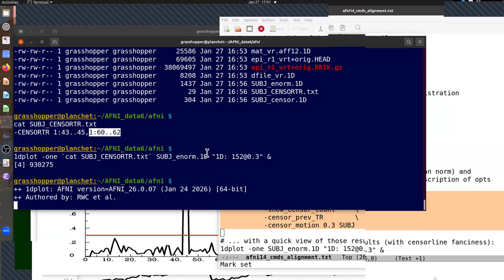Or you can use a reverse phase encoded data set and estimate the difference between warped in one direction and warped in the other direction. You take the kind of average and hope that averages out to be not warped. So both of those methods of correcting EPI volumes rely on doing a little extra acquisition at the scanner. If you don't have those, you can't use them.